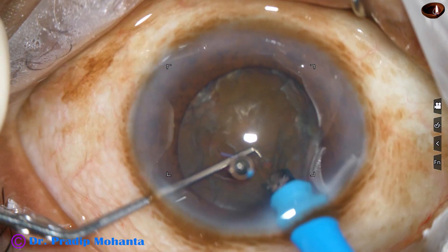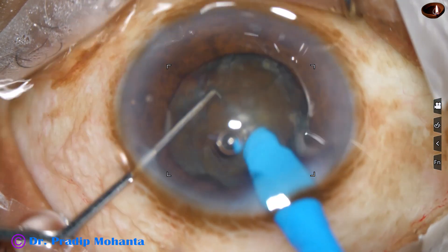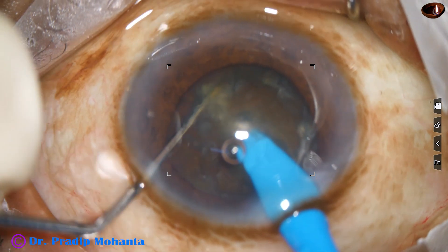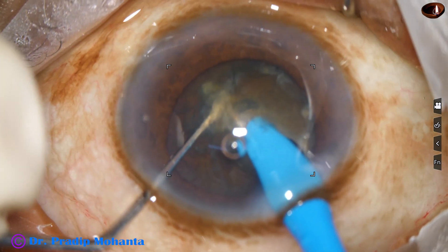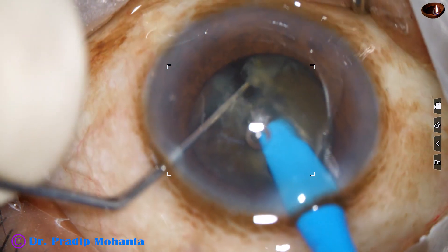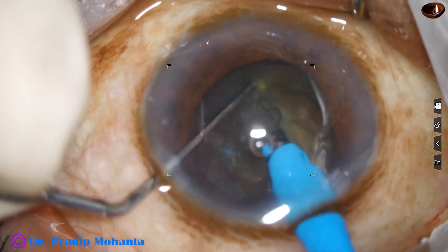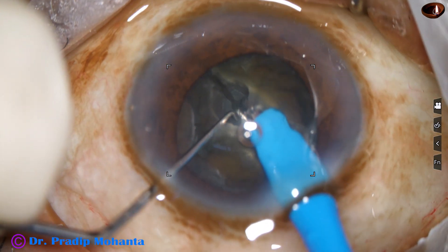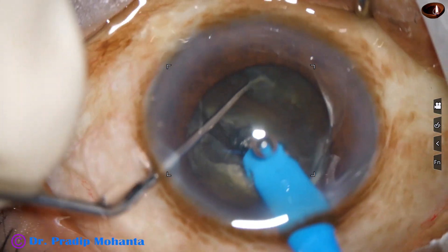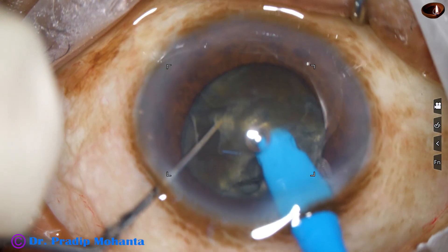This is submarine chop. The tip goes into the substance of the nucleus just in front of the main incision, and travels through the nucleus just as a submarine goes under the surface. This produces a nice crack. The nucleus is rotated 180 degrees, we come to the other side, sculpt, and hold this hemi-nucleus with vacuum.